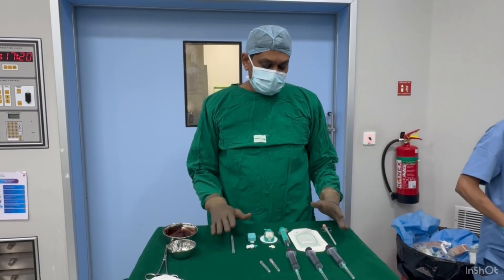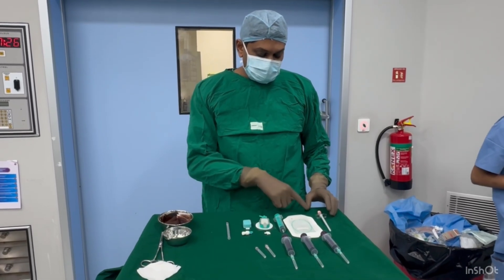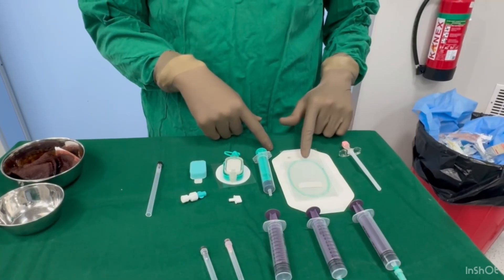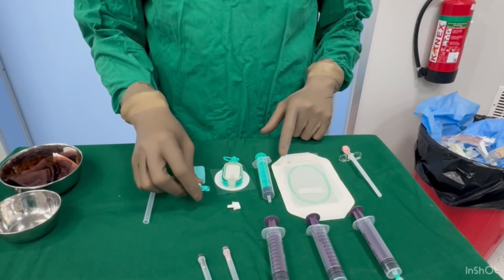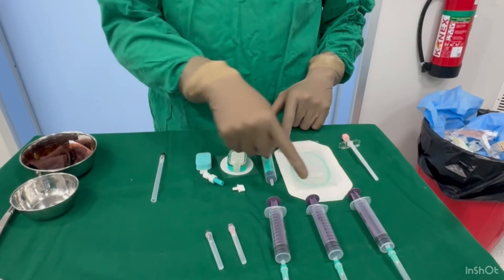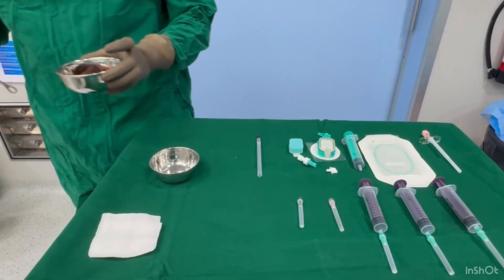We are planning a caudal block with a nerve injection. We have an epidural set with an 18-gauge needle and epidural catheter with a syringe, a catheter lock, a 22-gauge spinal needle, a 10 cc syringe, and an 18-gauge and 26-gauge needle to clean the site with betadine.